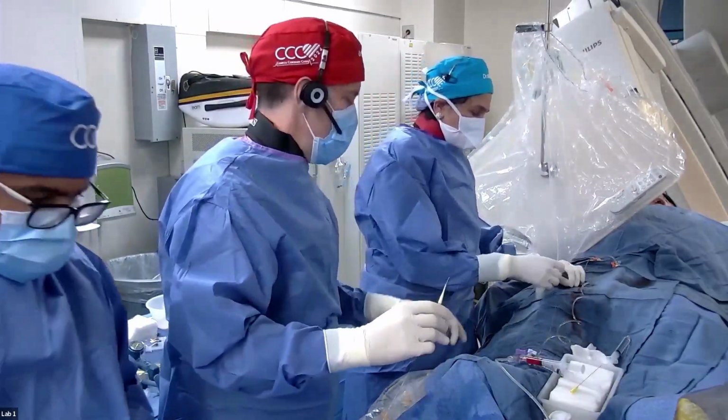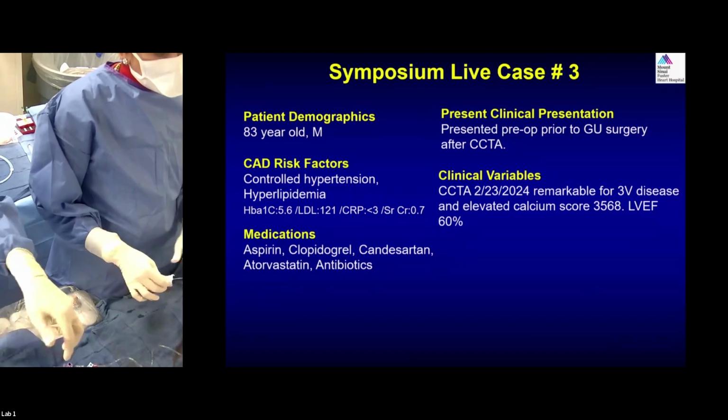Open it. It says diffuse calcific bifurcation lesions. Let's see what you got.